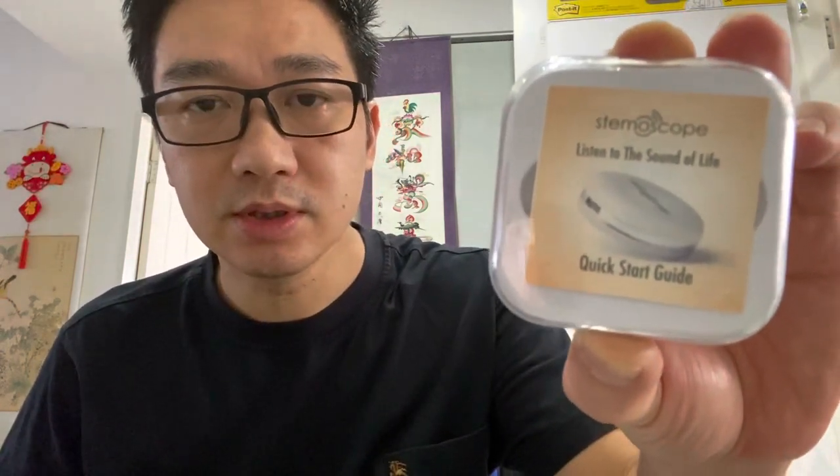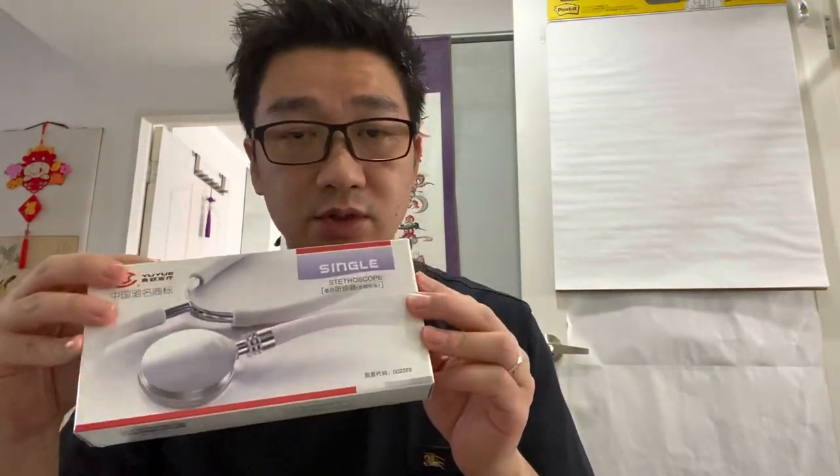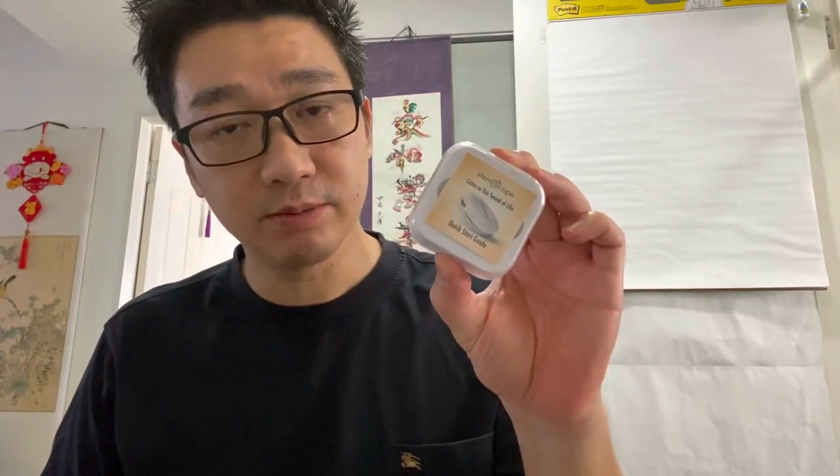Hi everyone! Today I've got a new digital toy - it's called a Stemmoscope. It's supposed to replace traditional stethoscopes. This Stemmoscope was created a couple of years ago through crowdfunding, Kickstarter or whatever, and they created this digital device.